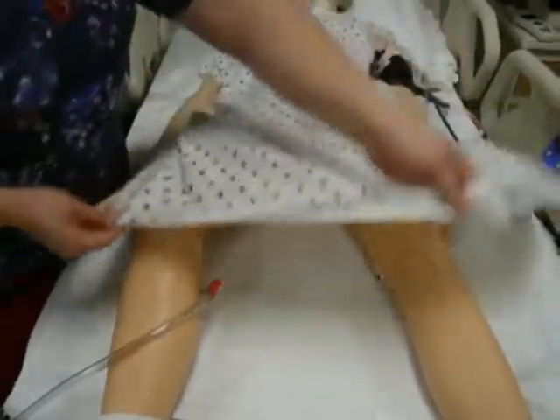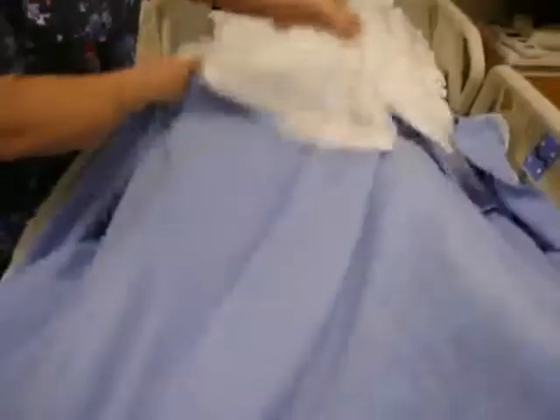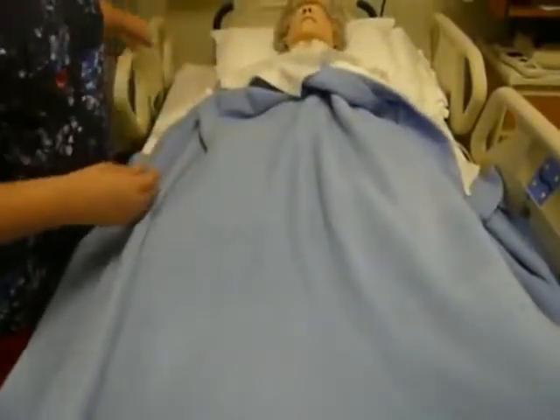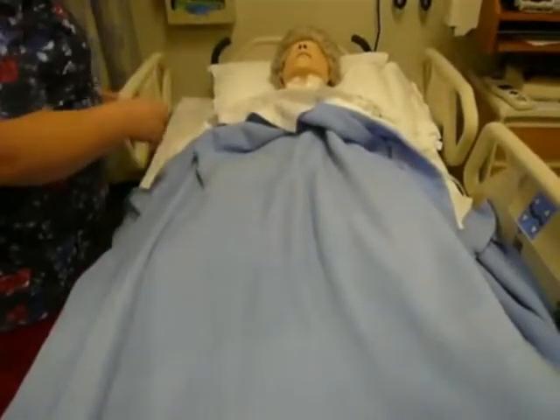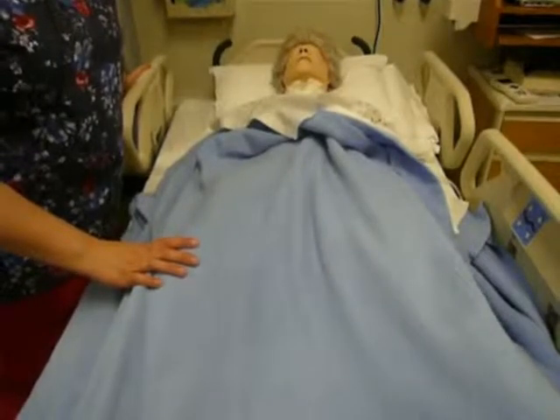Make sure I put the bed down. When I have the bed down in the starting position, I can put down the extra side rails I had up across the bed because I was by myself putting this catheter in.